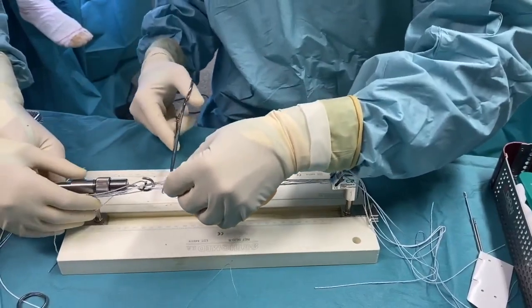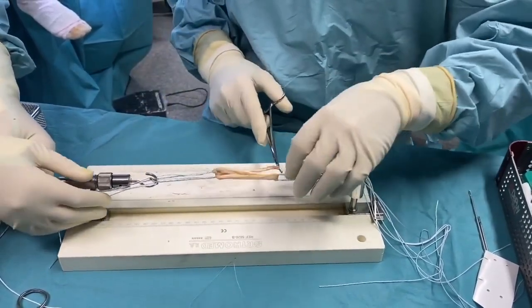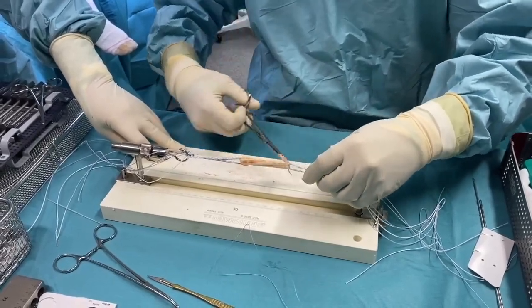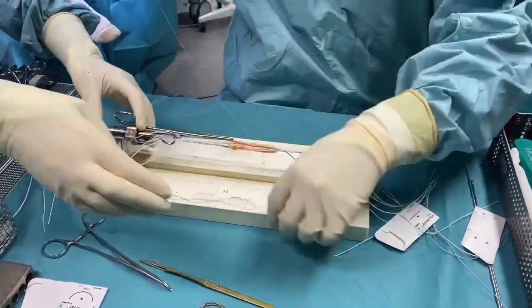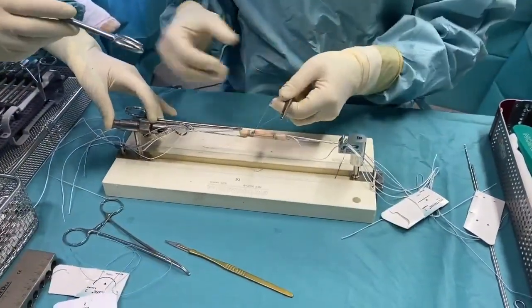The graft is completed by passing the tendon in the loop of each end of the button until a four-strand graft of the desired length is obtained. These strands are strengthened by setting each end of the graft with non-absorbable thread.